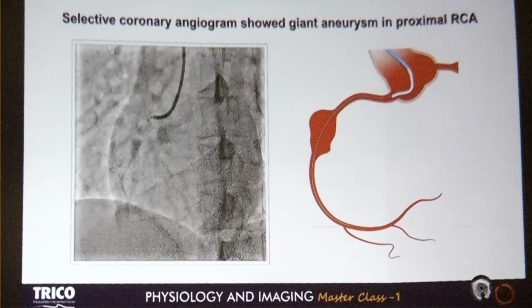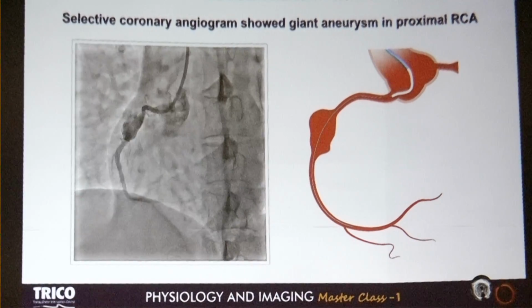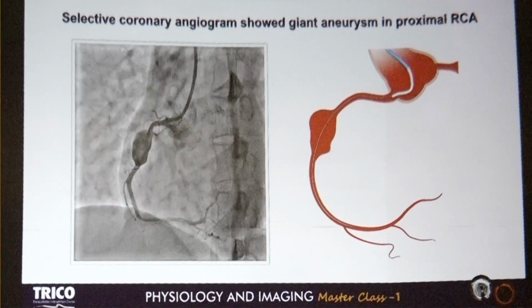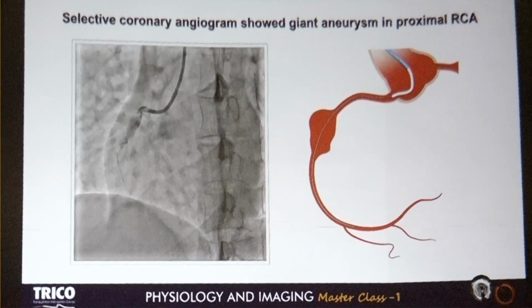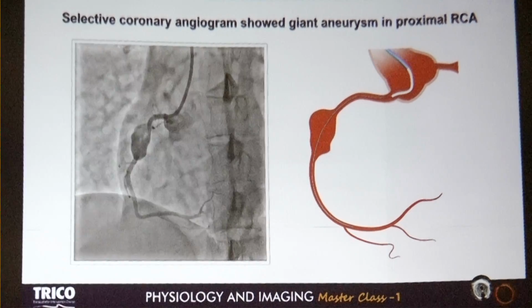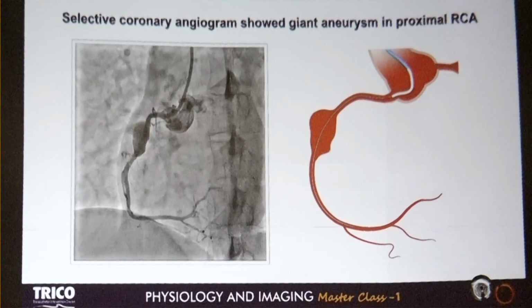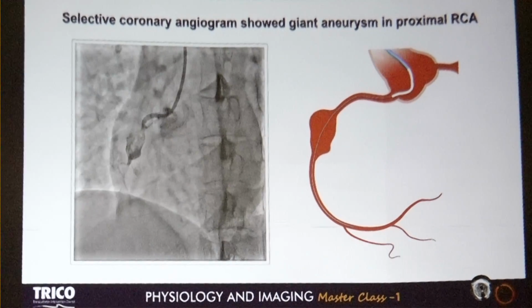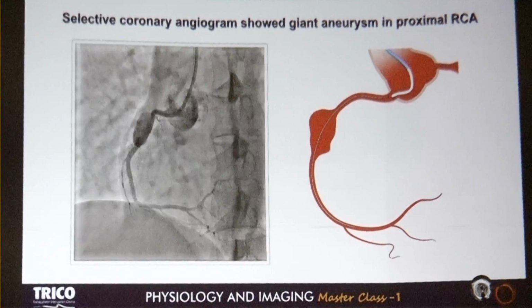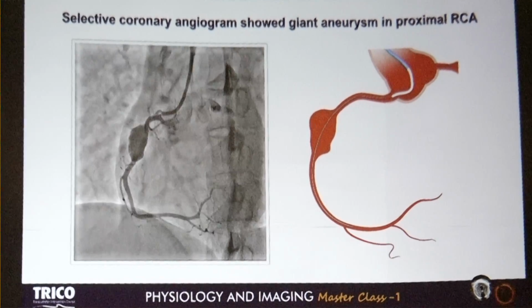You deploy one stent and then you put another stent, and if that covered stent doesn't go inside the previous one, then you are stuck and the whole area is a very loose area. Here, my colleague Sanjay came out with a brilliant idea. He told that let us prepare a platform using a longer metal stent, and then we can use overlapping covered stents to fix it.